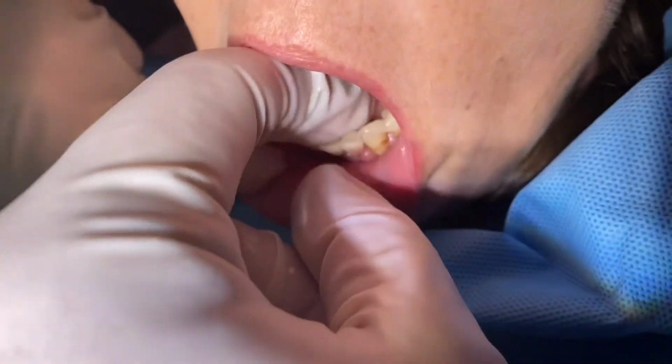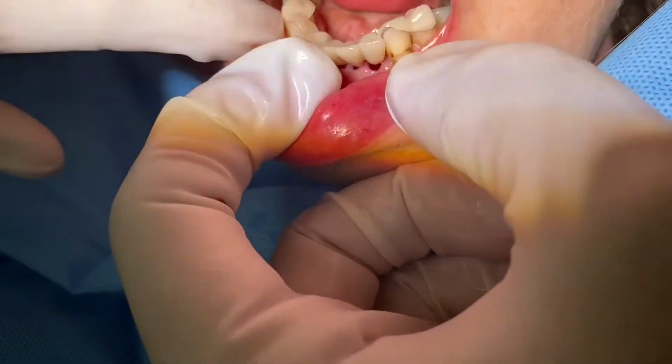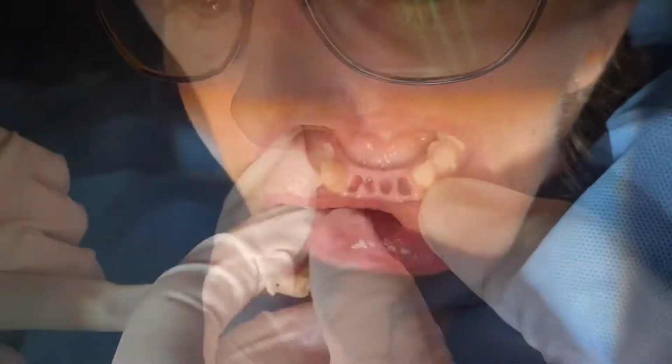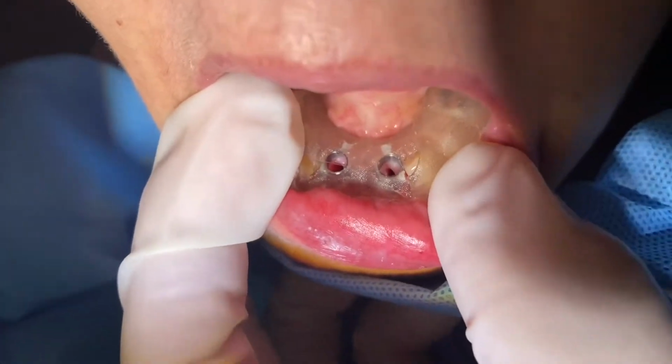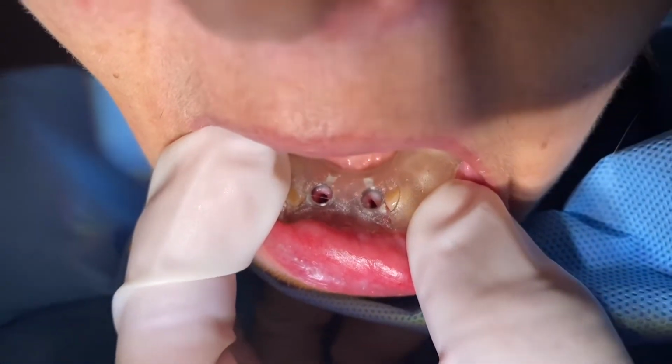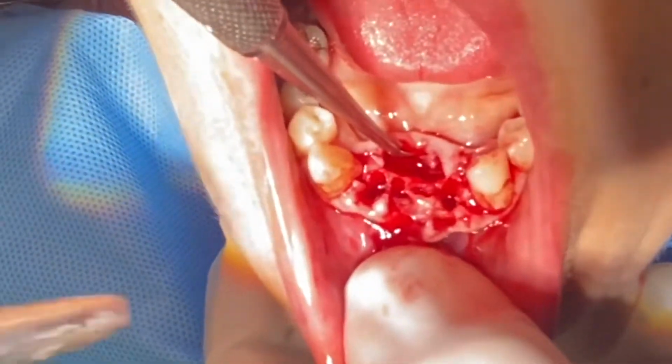So the extractions went uneventful, and the patient is just moderately sedated here. She's doing okay. This is not a big procedure for her. So when we're going through this, we can see that our goal is to get this cleaned up. So we'll go in, curette those areas, go back and place the implants.